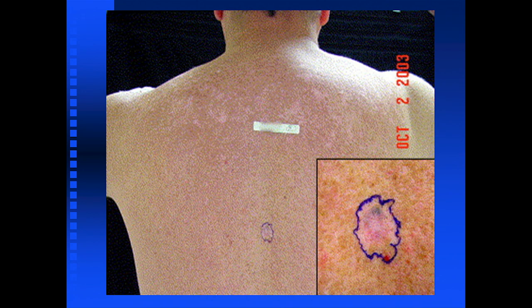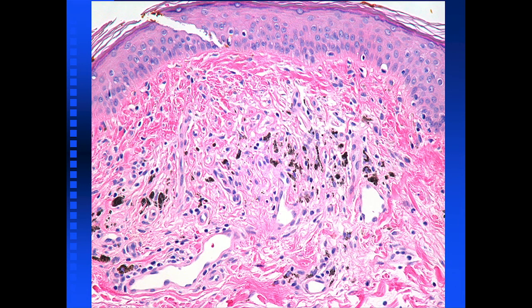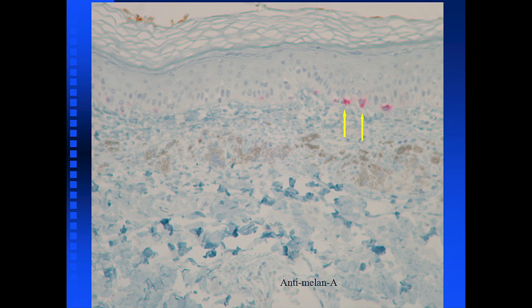Let me tell you about a case that really happened at Mount Sinai. We had a 53-year-old male with a several-month history of a variably pigmented skin lesion. Here's all it shows: there's a row of melanophages, a little bit of coarse fibrosis in the dermis, and prominent vessels. There's not much at the dermoepidermal junction. Another view shows coarse collagen and variable pigment in the dermis.